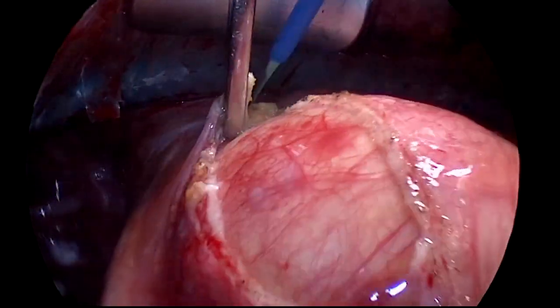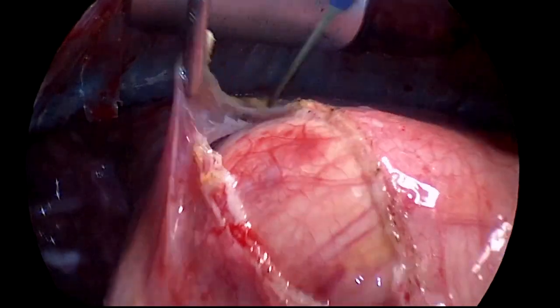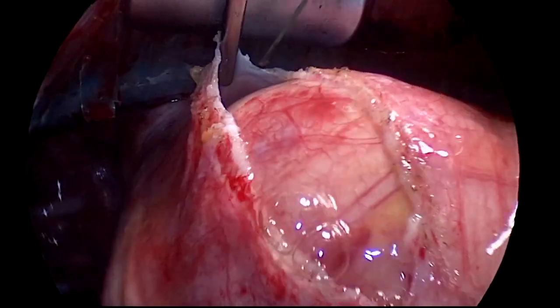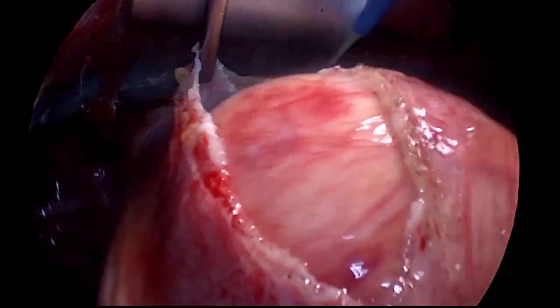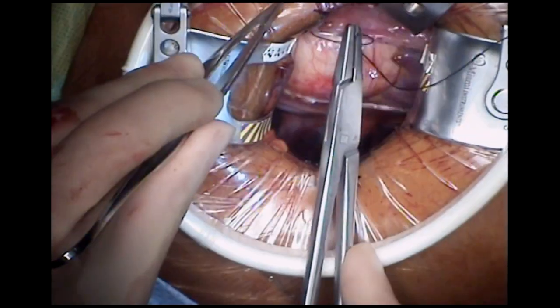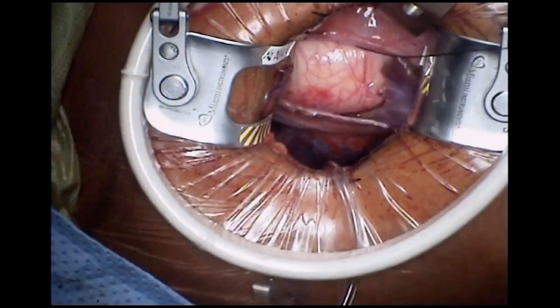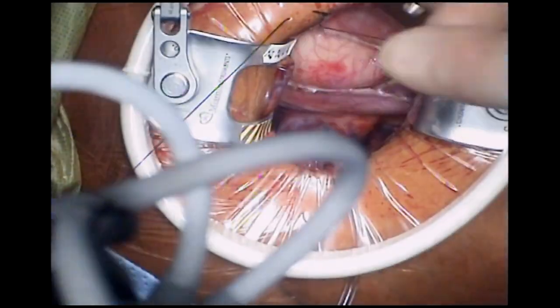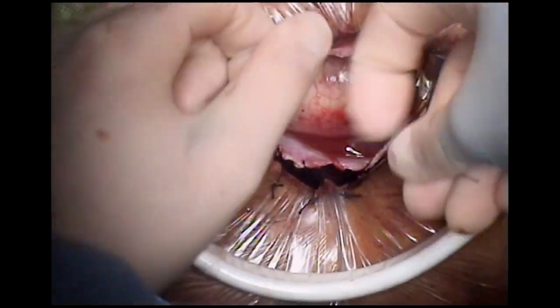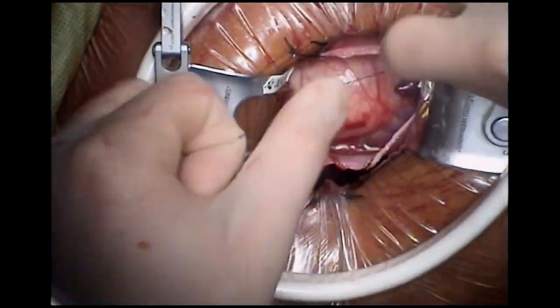The superior extent of the pericardiotomy extends to the level of the pericardial reflection on the aorta. It is useful to identify the innominate vein as a superior landmark. Pericardiotomy is extended inferiorly and teed off, and multiple pericardial stay sutures with pledgets are now applied, providing excellent exposure.